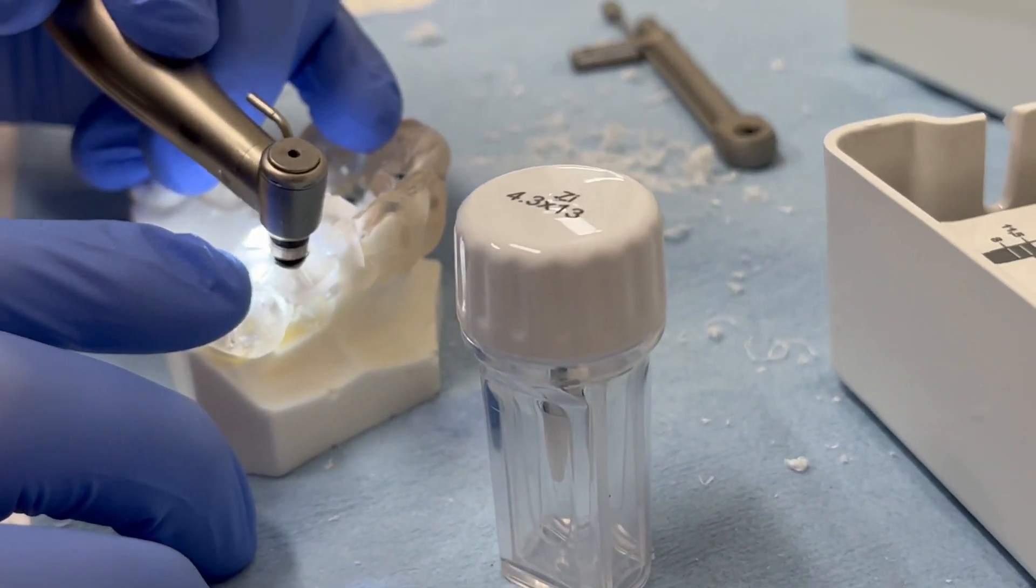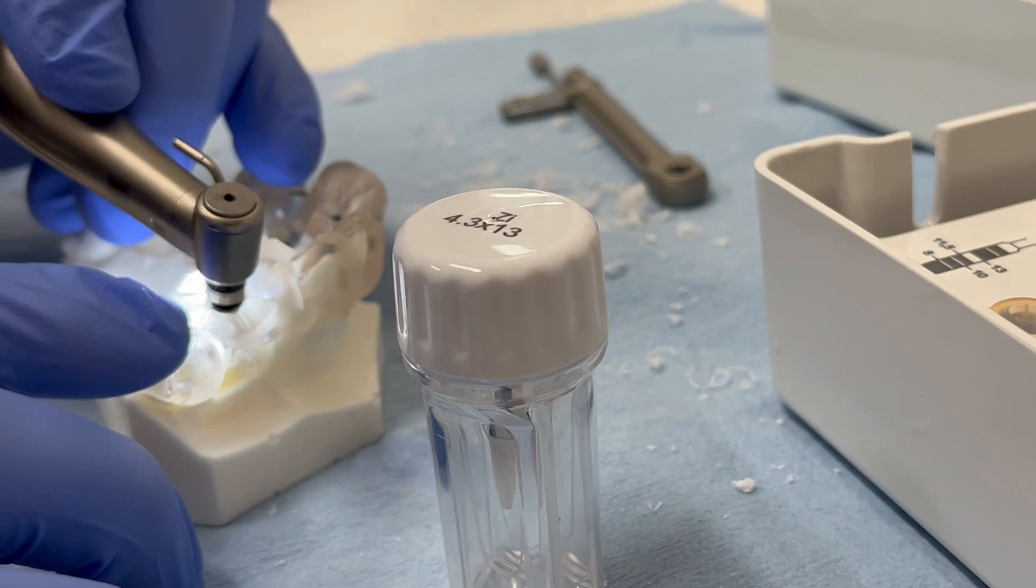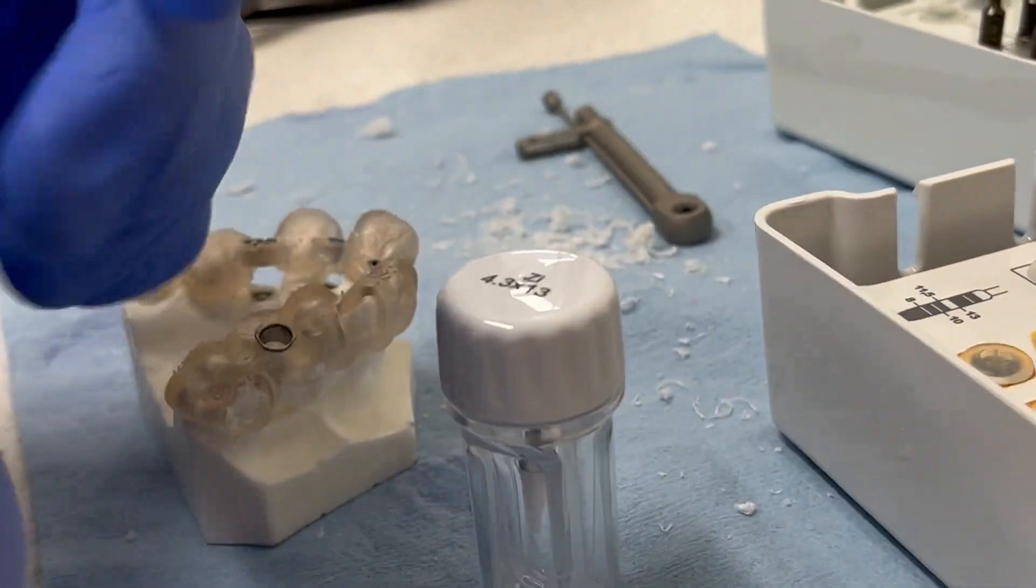So now we're going to do the same thing. Down in, pump, relax, pump, relax, just until we get that down to the stop. And now we are good.